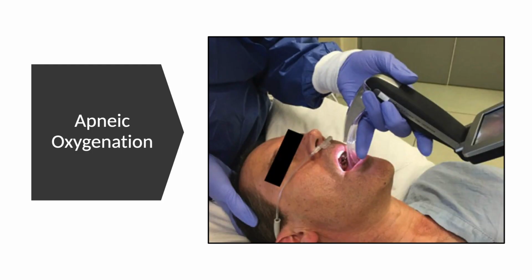One thing you can do to buy yourself a little bit longer look before your patient desaturates is apneic oxygenation. So if you're able to set up a nasal cannula with high flow that's passively oxygenating your patient while you're taking a look with your scope, this has been shown to prolong the amount of time that the intubator can actually take a look and attempt this procedure. So apneic oxygenation is a very nice tool, and I would highly encourage you to use it if you have it available or have the time.